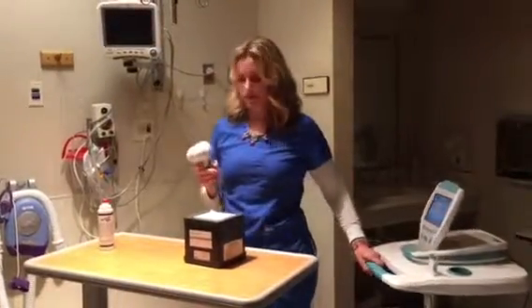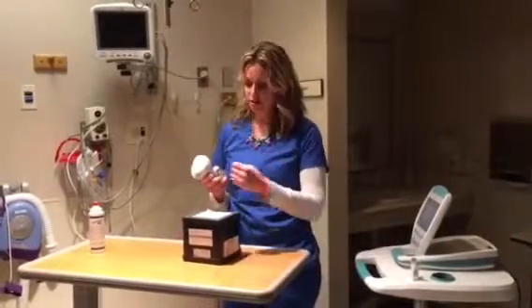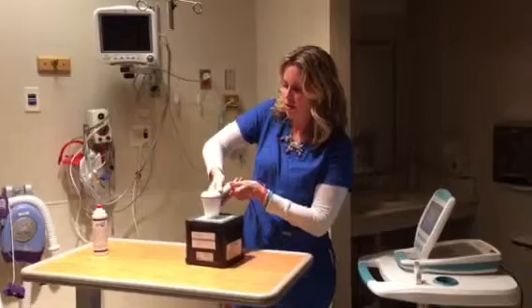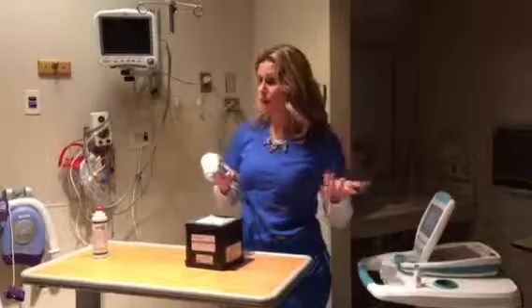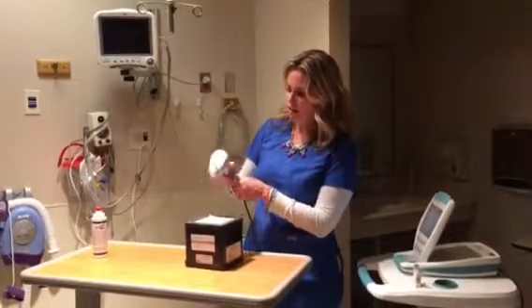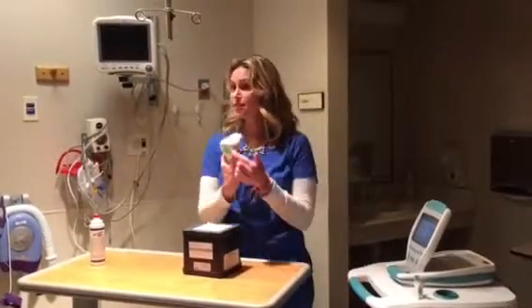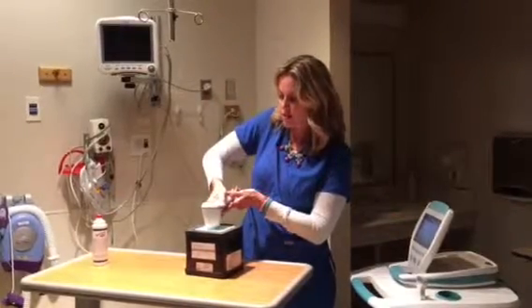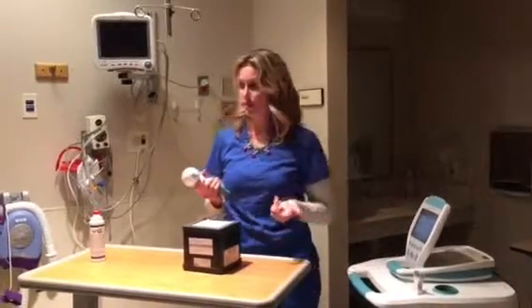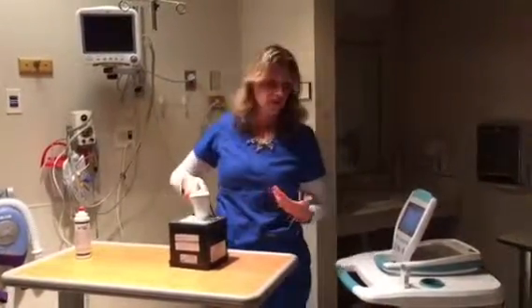But there's a couple of ways to get a false positive. The first way is if you're not following the proper procedure. So I place my gel, place my probe, press my trigger, the 3 Ps. And then lastly, I listen for that chime. So if I press my trigger and then place the probe, I'm actually scanning the air for a couple of seconds. So I still get a reading of 8 arrows flashing, bladder, and the crosshairs. Or if I press the trigger and then I remove it before that chime, that's again a way to get a false positive. And then the last way is if you're actually moving the probe around while you're scanning.